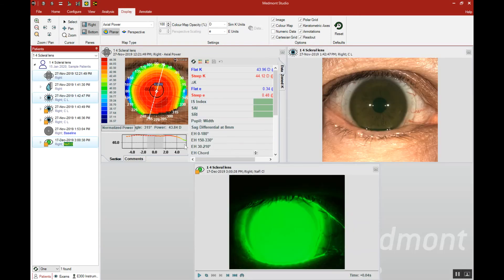The Medmont topographer has great application in so many ways. Using the estimated height attribute we can choose the initial lens based on the estimated depth of the anterior chamber to the exact chord of measure of your particular scleral lens of choice. We can also do imaging of both the contact lens in white light to observe its landing and the scribe marks where the flat meridian of our toric is. We can do fluorescein analysis and video of the lens. All of these tools are very valuable to us in our scleral lens practice, and we can export this information to communicate it to the lab or for assistance from our GP lens consultant.